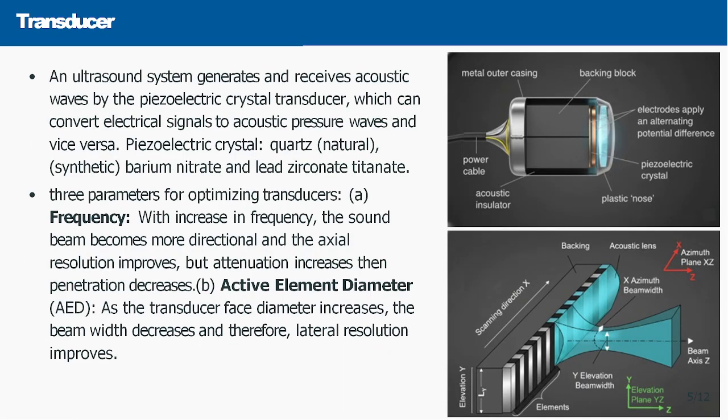Now, the transducer. Basically we are using a piezoelectric transducer that contains one piezoelectric crystal. We can see here the main part is this piezoelectric crystal, and this crystal will vibrate. Once the echo is captured, it will vibrate the crystal, and through this wire the equivalent current or voltage can be captured, and we can take that for amplification, which can be converted to its equivalent electrical signal.